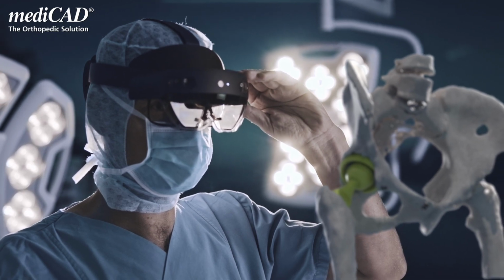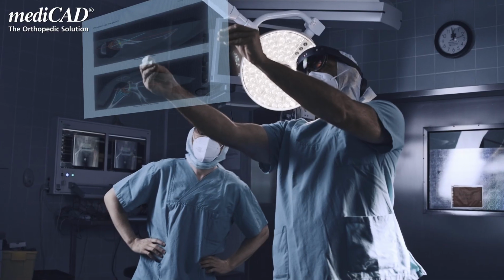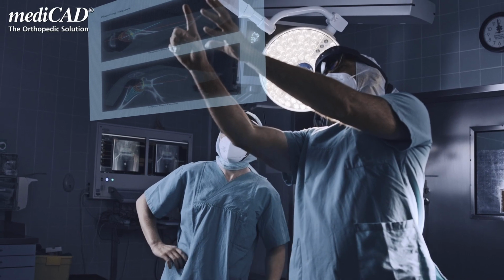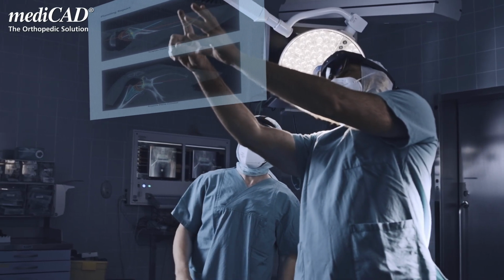The streaming function of HoloLens combined with mediCAD software is very important, because there are always intraoperative situations that may require a second surgeon. The more complex the procedure, the more a second opinion may be needed, even intraoperatively. In some cases, I would be wise also to involve various representatives to ask questions if necessary. Streaming makes these features possible, and we will need these more and more for the benefit and quality of our patients.